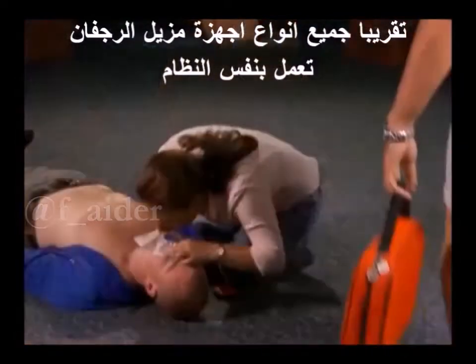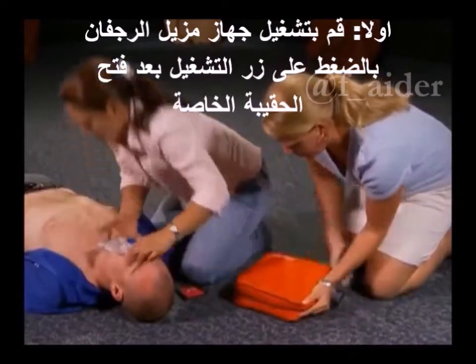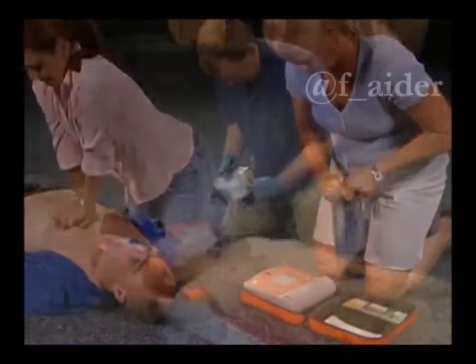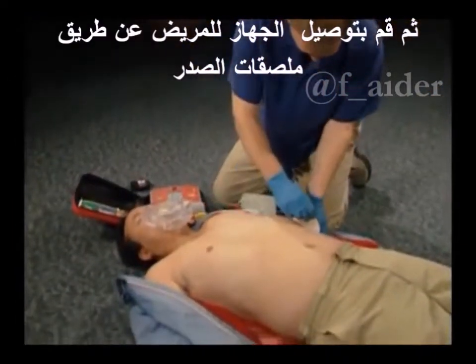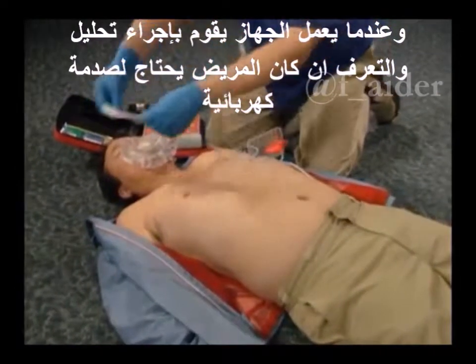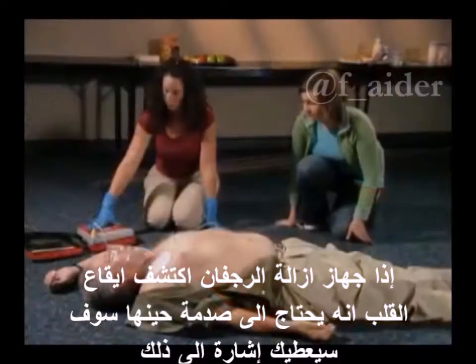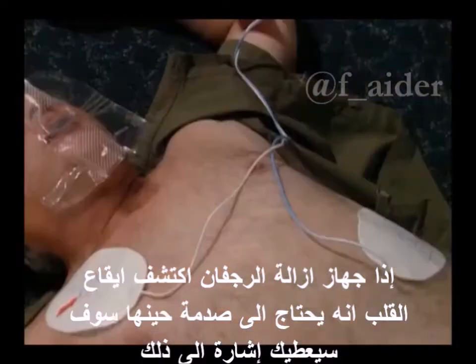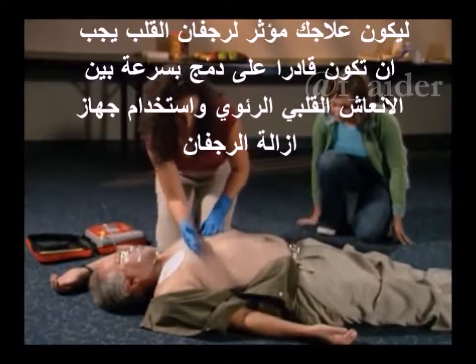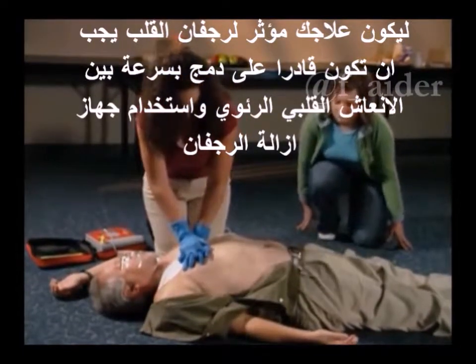All AEDs function in the same basic way. First, you turn the AED on by either opening the unit or pushing the appropriate button. Next, connect the AED to a patient via 2 chest pads. When the AED is turned on, its computer analyzes the patient's need for a shock. If the AED detects a heart rhythm in need of a shock, the machine will indicate that a shock is advised. To effectively treat heart fibrillation, you must be able to rapidly integrate CPR with the use of an AED.